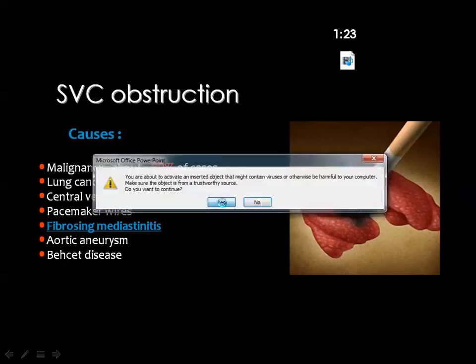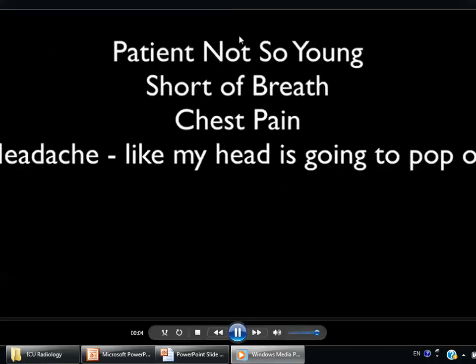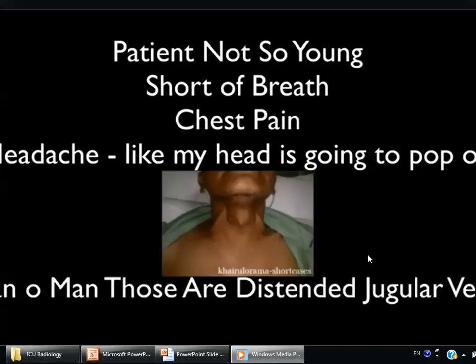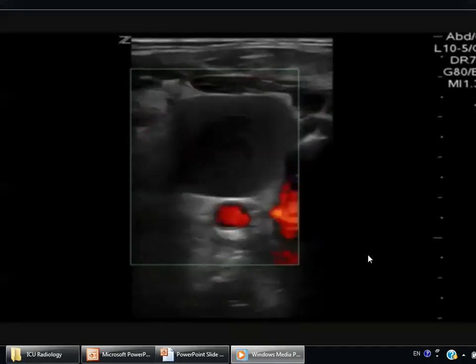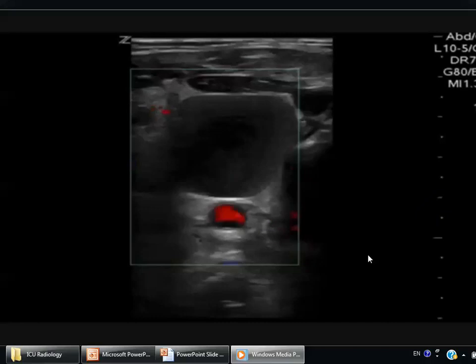This video, I think, will show. You've got a patient in bed C3. It is not such a young patient. They are short of breath, have some chest pain, and they describe this headache. It just feels like their head is going to pop right off. Have you ever had this presentation before? You go onto your physical exam, and one thing that really stands out is, man oh man, those are some distended jugular veins. So you quickly fight the urge to throw a central venous catheter in, and you start your diagnostics, beginning with a point-of-care ultrasound.